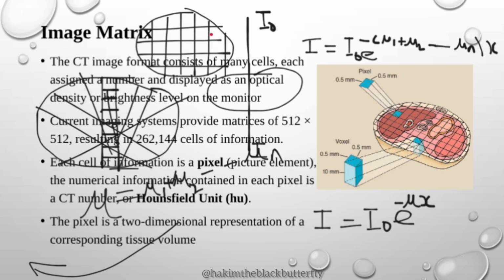Now just imagine when it is to create maybe 32 slices. So 32 times 262,000, those are the equations that it has to calculate to give you slices in just seconds. So image reconstruction in CT is mathematics, not projected images. It is just mathematics.